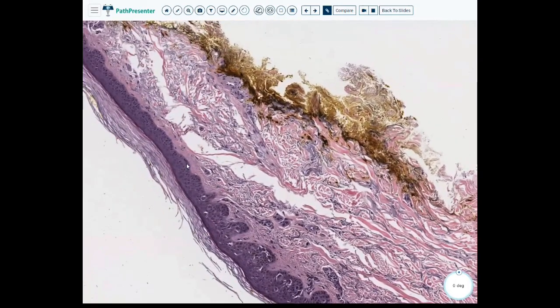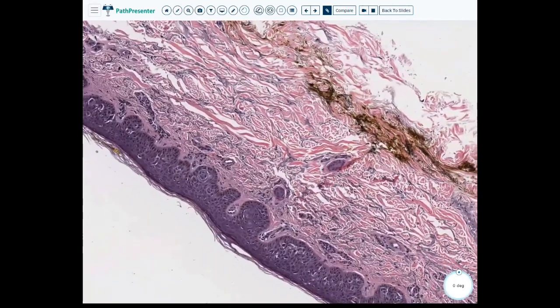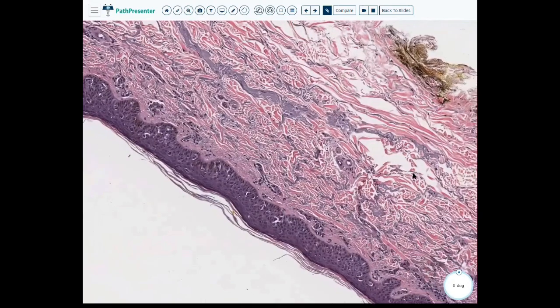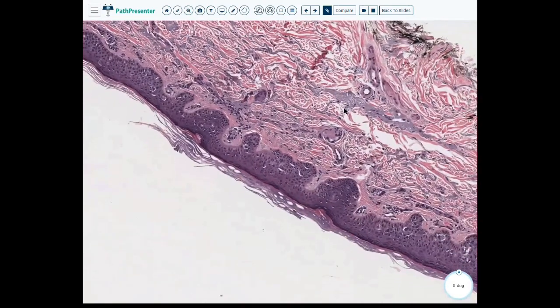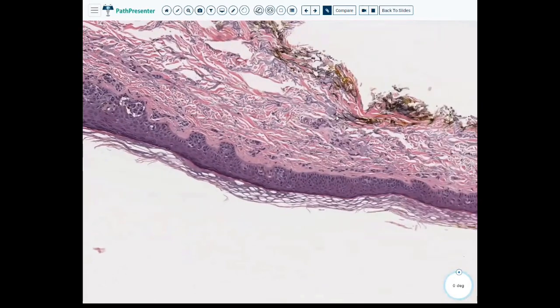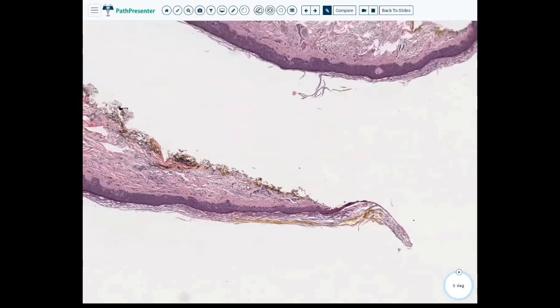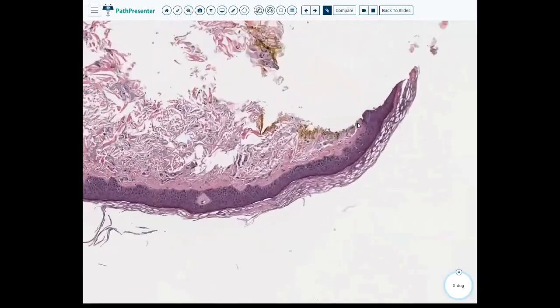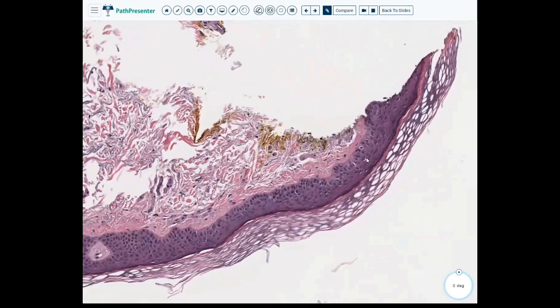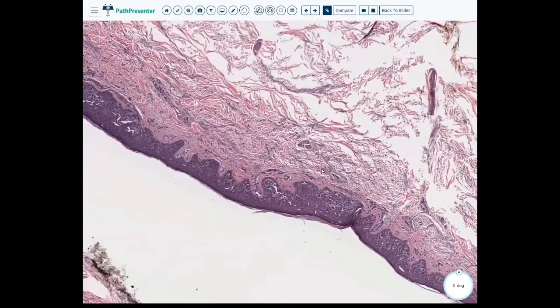And this kind of almost has a lentigo pattern where it has this lateral spread, but it's really just like a speckling. So I'd probably still just leave this as melanoma in situ, not otherwise specified. It doesn't look like it's involving the margins. It's getting close, but let's see the other side.